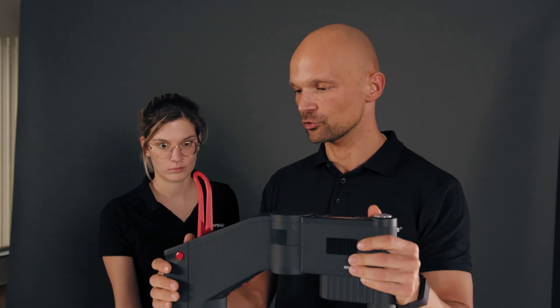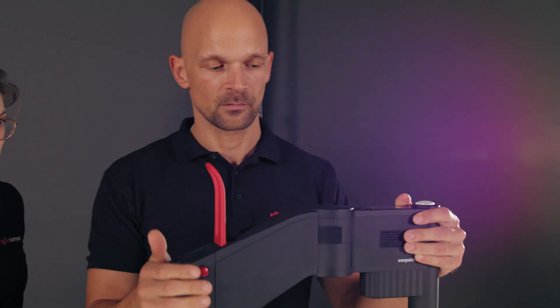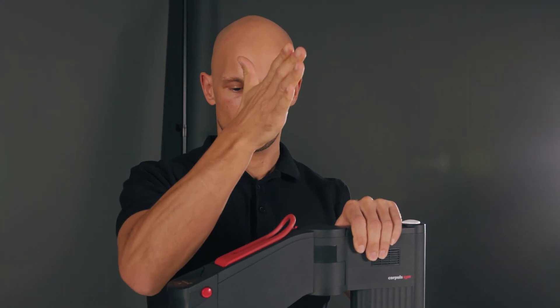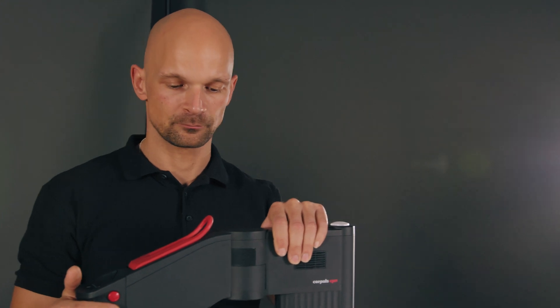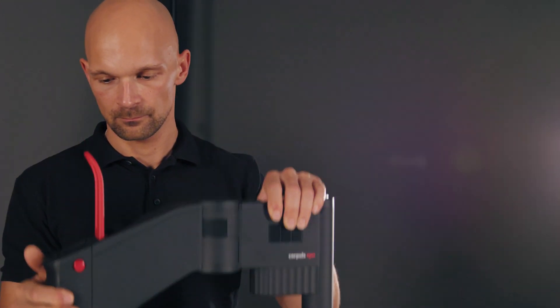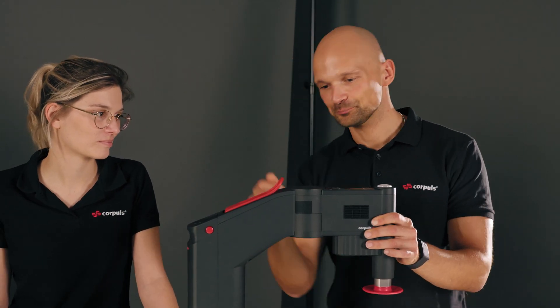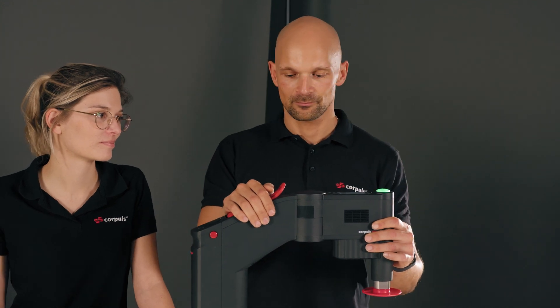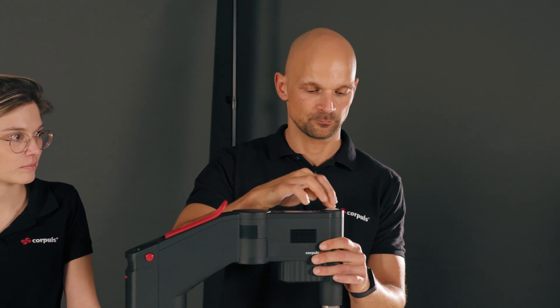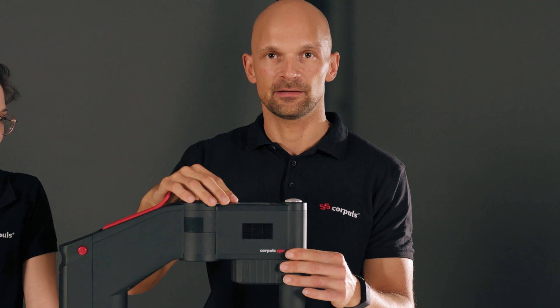As soon as the locking lever is closed, all the joints tighten again. Closing the locking lever should be done with the palm of your hand, with a slapping motion to prevent your hand from getting caught. The Corporal CPR can be switched on under the arm. I start the therapy by pressing the button on top, and to end the therapy, I press it again.